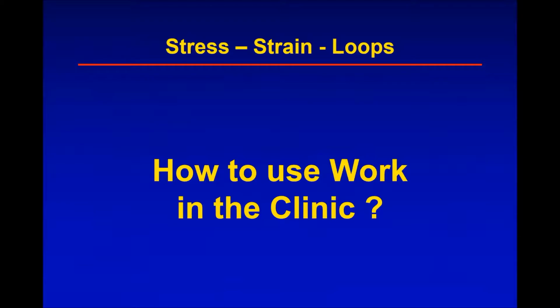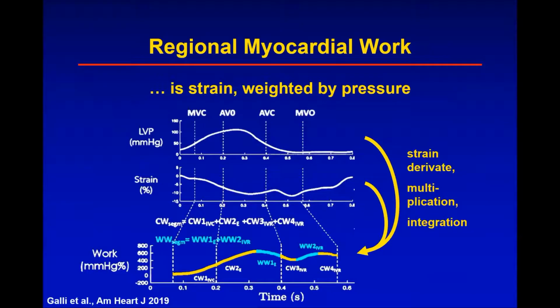Because this was all with extra software and extra calculations. Yes, we can also use that in the clinic. But we have to keep in mind that we are using just the strain and just the left ventricular pressure. We do not consider wall thickness or curvature. And in that sense, it's basically a strain which is weighted by the pressure. In other words, we look at the systolic part of the strain.